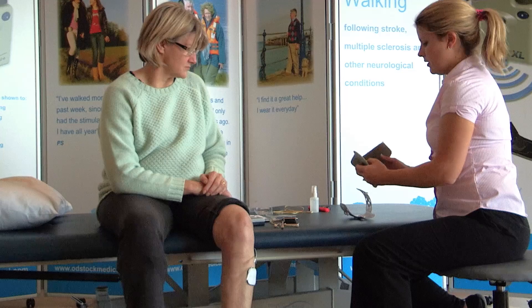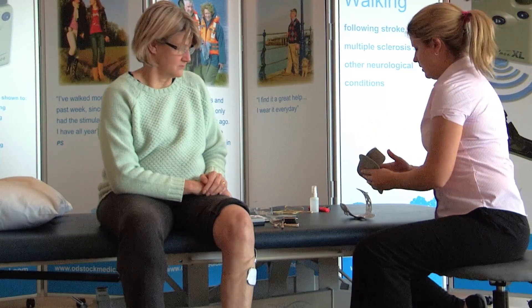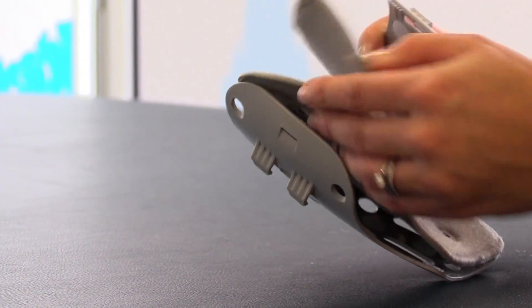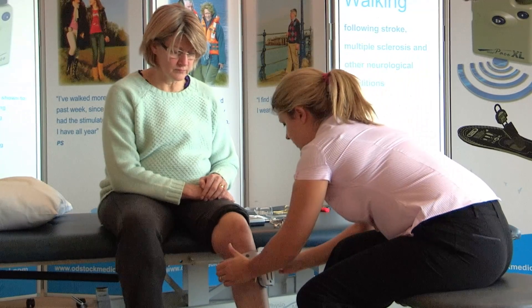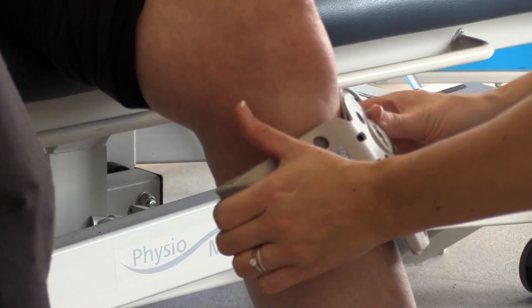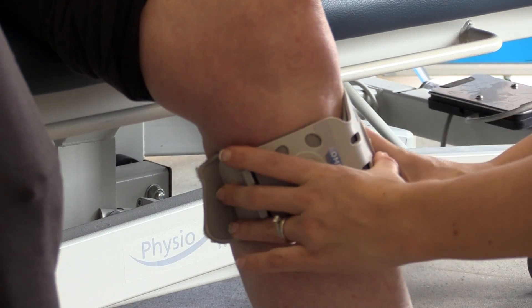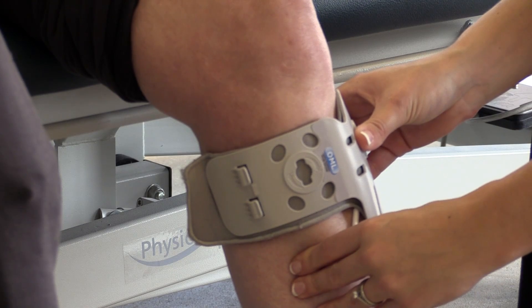Take the liner and fold it in half at the point of the notch. Place it into the leg cuff and lay the liner down onto the Velcro. Open up the leg cuff, line up the notch with the tibial tuberosity, and place it over the top. Push down to encourage the electrodes to stick to the liner.